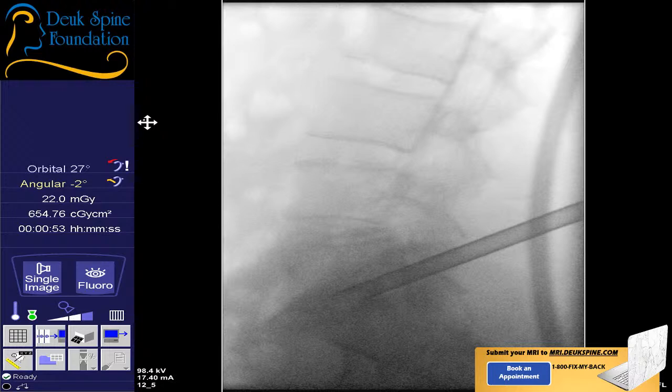Yeah, laser. So there's the herniation right there. The tear and everything. All that, see that stringy stuff? Okay, all right, let's talk about it. You see the yellow thing that looks like an octopus head? That's a piece of fat, but it's scarred. All right? That's all epidural fat.